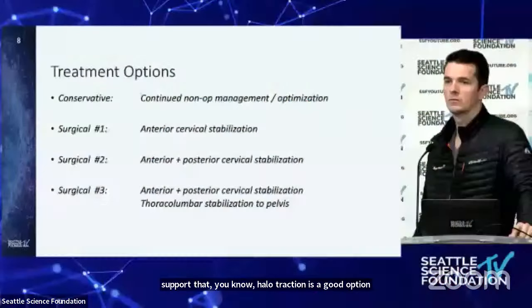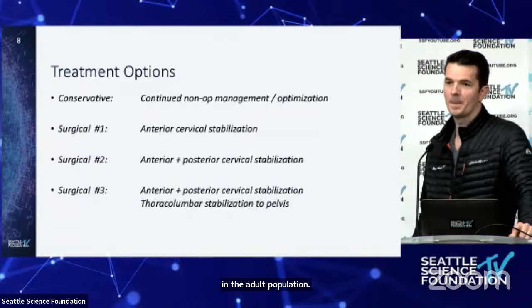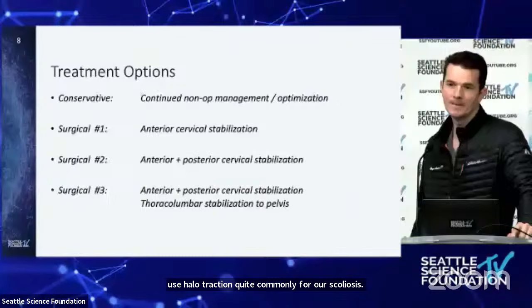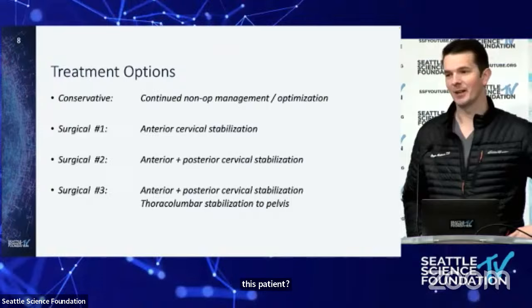In your home institution, Brian, have you used traction for protracted or complex deformity corrections? In the pediatric population, yeah, we'd use halo traction quite commonly for our scoliosis. Would this have been an applicable consideration in this patient? Absolutely, yeah. Well, we did use some form of that intraoperatively. Over a sustained period of time, 2 to 3 weeks?